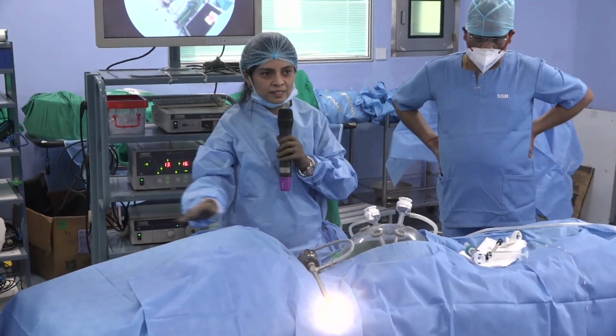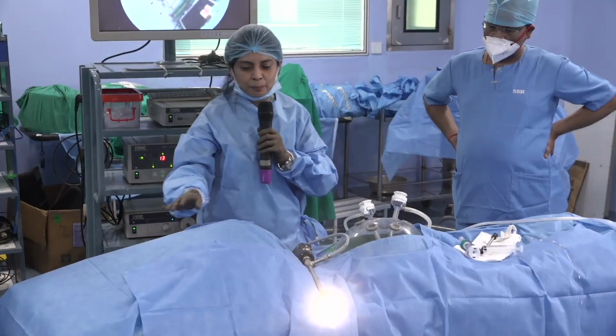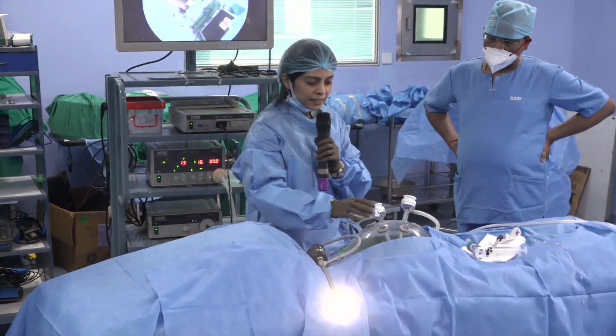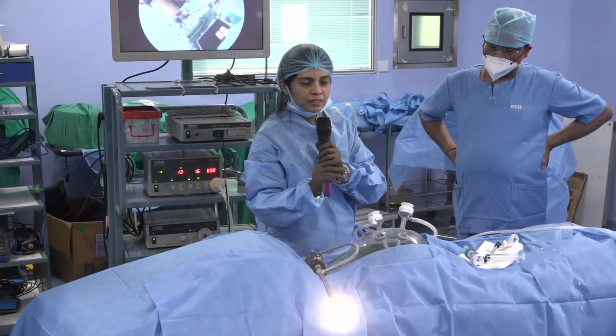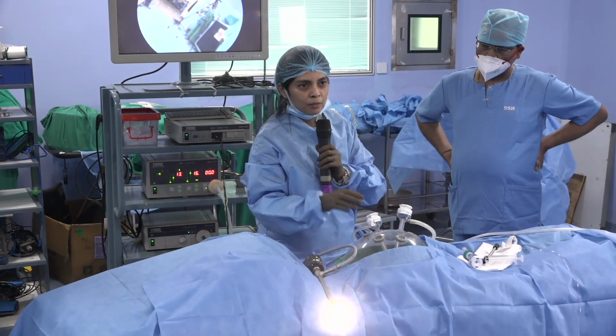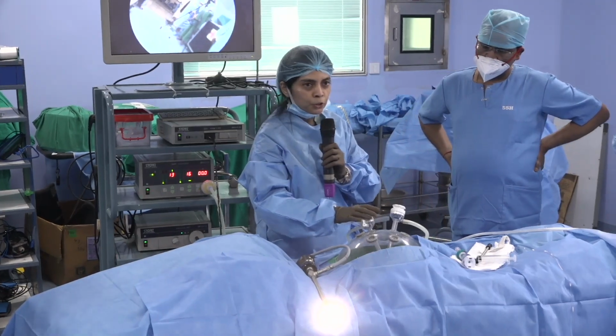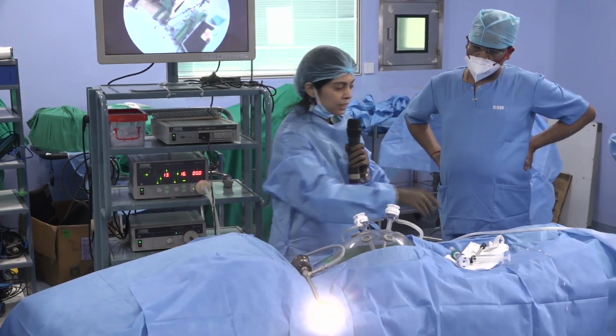Okay, so this is our demo patient, right? And this is the abdomen. So what we need here are two ports, as I was telling. One is a 5 mm port and the other is a 12 mm port. But here we have only normal ports that we use. I will show you how a balloon port actually looks.